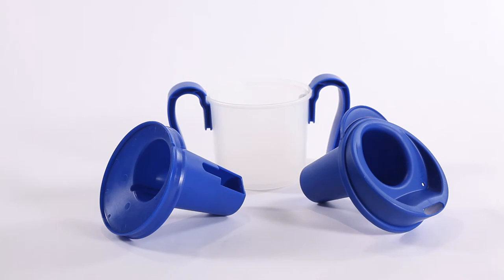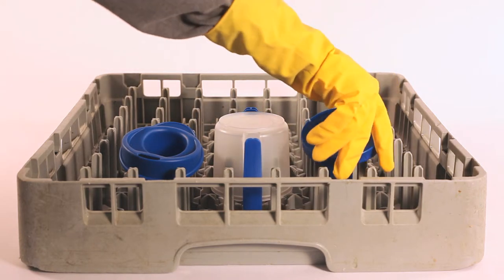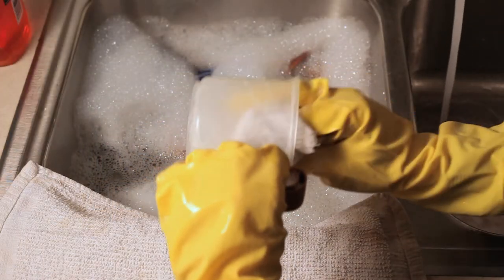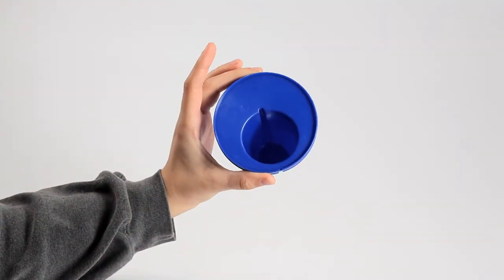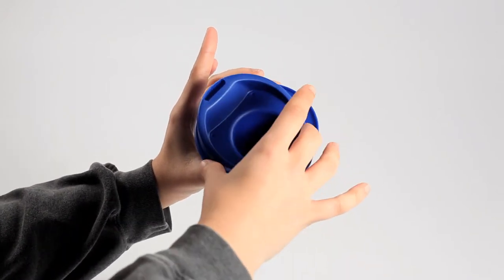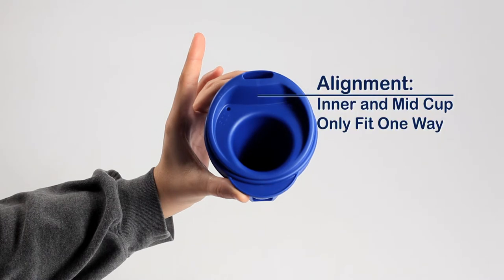Before patient use, the ProVail Cup should be washed. After securing the handles, wash the cup lid, mid-cup, and outer cup. The cup can be washed in a household or industrial washer or by hand and then dried. After washing, assemble the cup lid and the mid-cup. Place the cup lid into the mid-cup and orient them correctly — by design, the lid and mid-cup can only fit together one way.